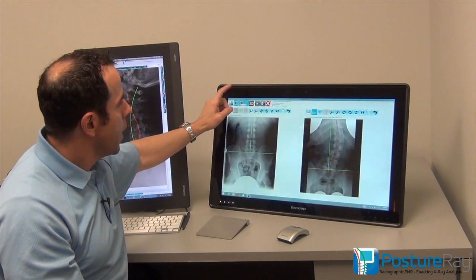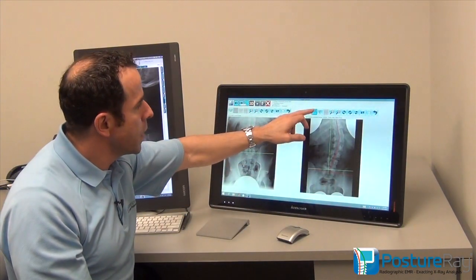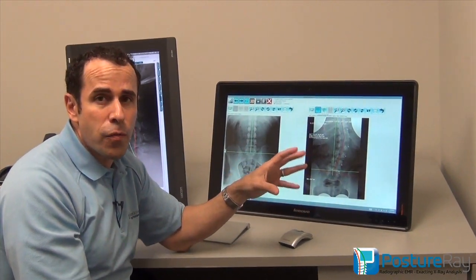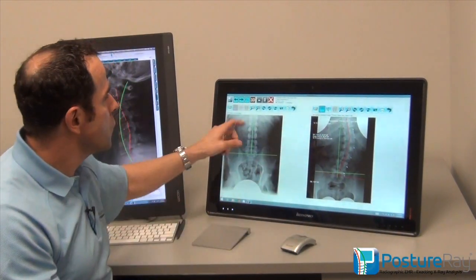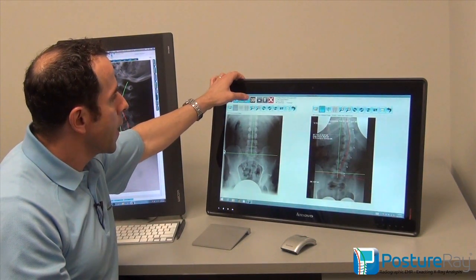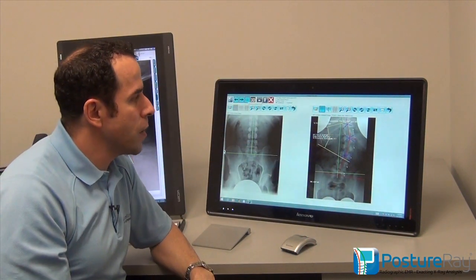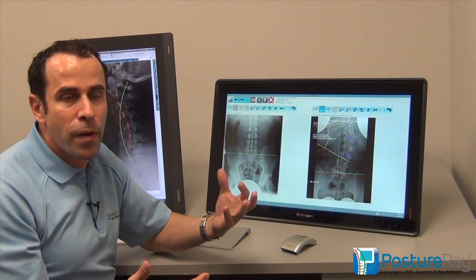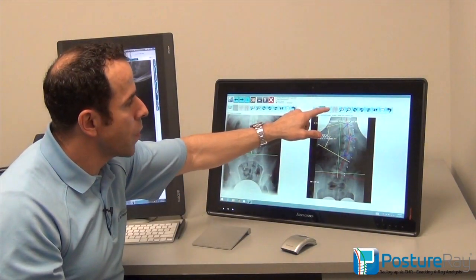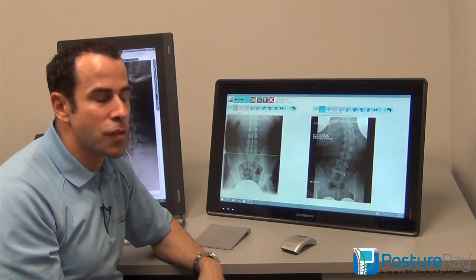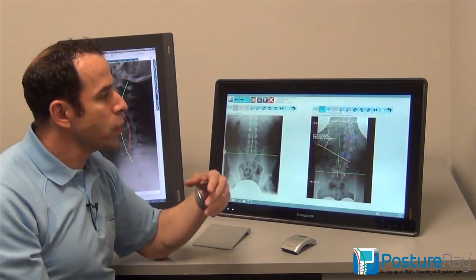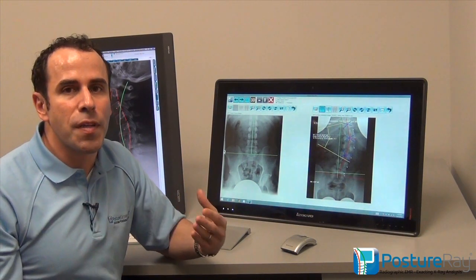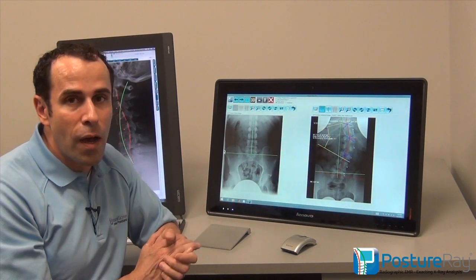For scoliosis we can not only overlay the findings of the Cobb and Riser-Ferguson values, but we can also put the Cobb lines and Riser-Ferguson superimposed right on top of the x-ray — it's already there. And I could even hide the lines if I wanted to hide everything, just like that. So at your fingertips, you're now getting the true understanding of how powerful PostureRay is.